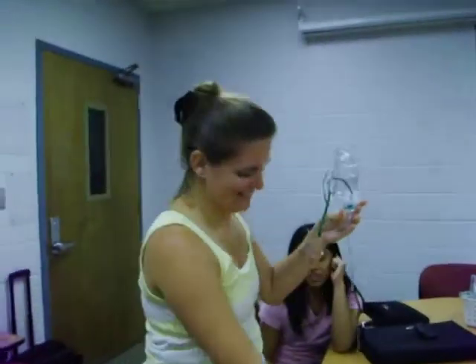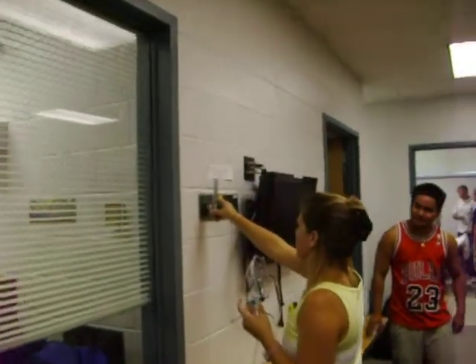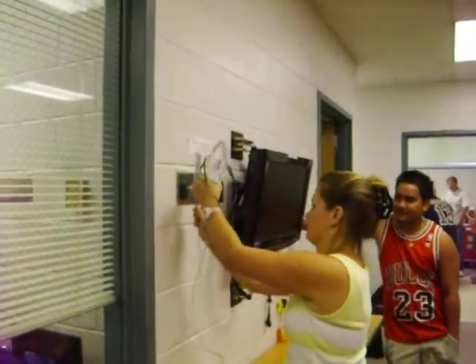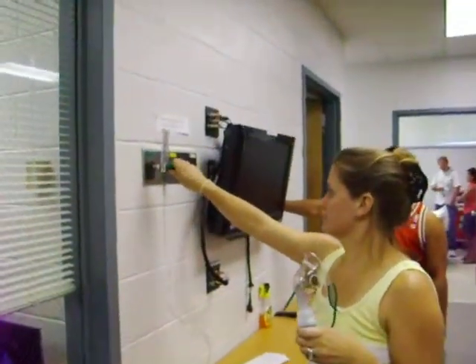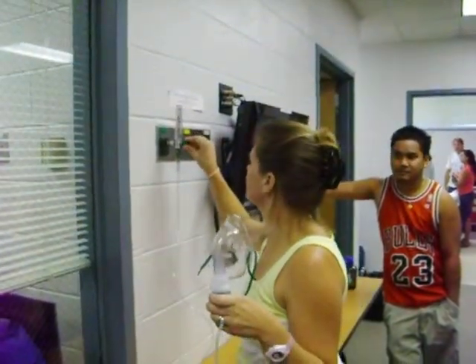Now, where's your flow meter? We need a flow meter. Hook it up. Then go to six or eight? Six or eight — go eight, just blast it. You get better particle size between six and eight, not above eight. Do you see a nice mist there?